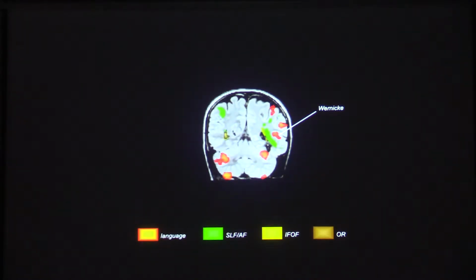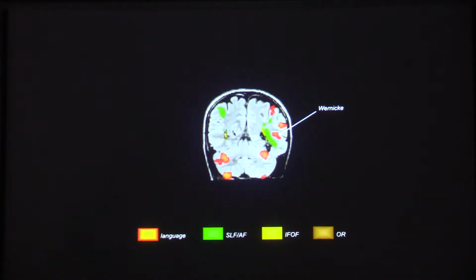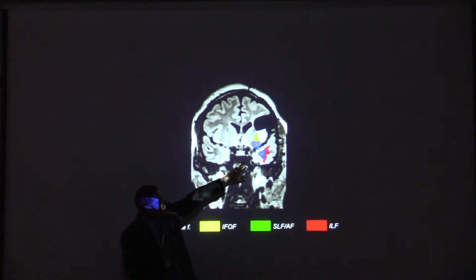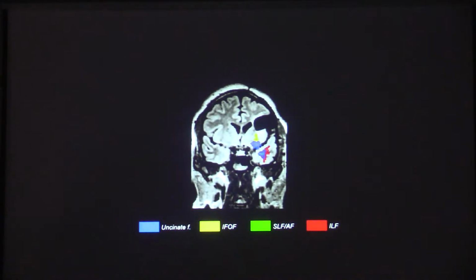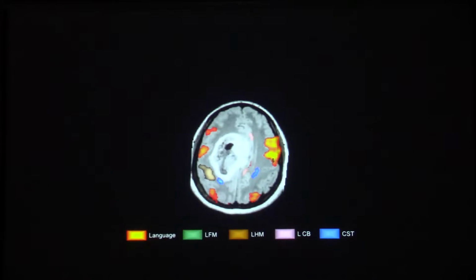With brain tumor imaging, we like to overlay some of our white matter tracts onto the brain, and then I'll talk about functional MRI later on. But this is a nice example of showing how different activation regions in the brain can be related to white matter tracts and in relationship to brain tumors, basically. So, for example, this one, there's a lesion in the frontal lobe, right? And then this is the uncinate fasciculus that's in blue that he wanted to avoid. Okay, so those are our brain tumor type stuff. And this one shows just the corticospinal tract, for example, being posteriorly displaced by this lesion in the superior frontal gyrus rather than lateral, for example.